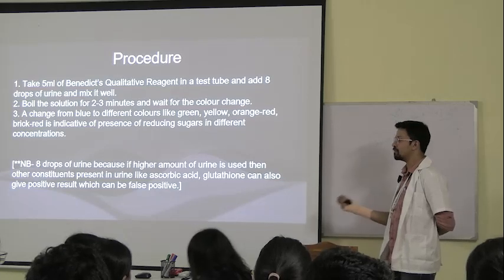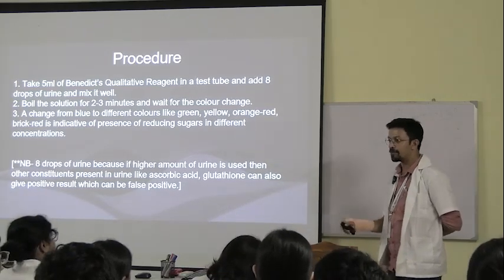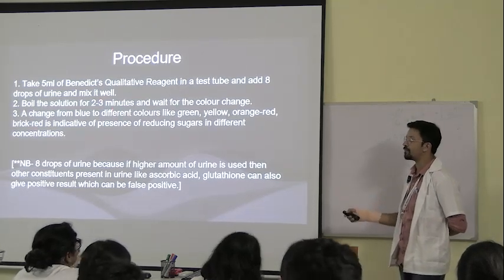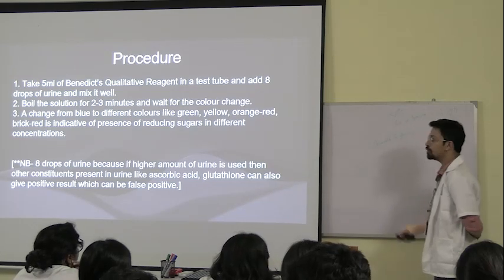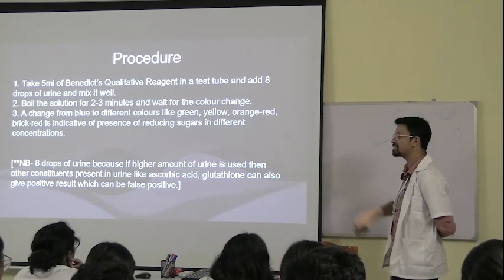During our test we randomly take 5 ml or 6 ml. But in labs, when you are practicing or somebody is doing this test, they have to take 5 ml, otherwise they will get faulty results. Okay? So that is why we don't take more than 5 ml or less than 5 ml. That is why we don't take more than 8 drops or less than 8 drops.